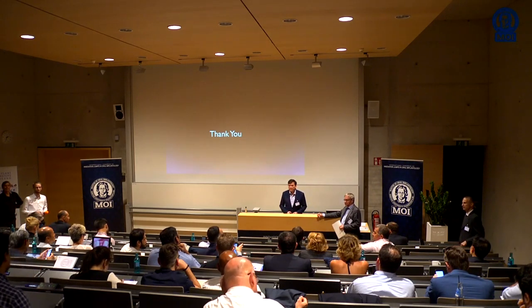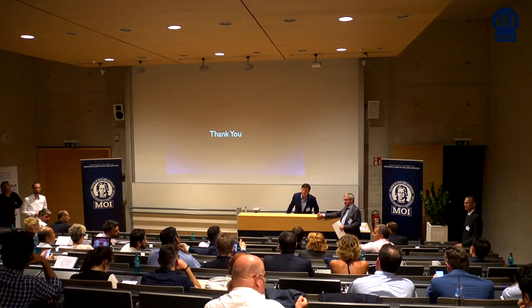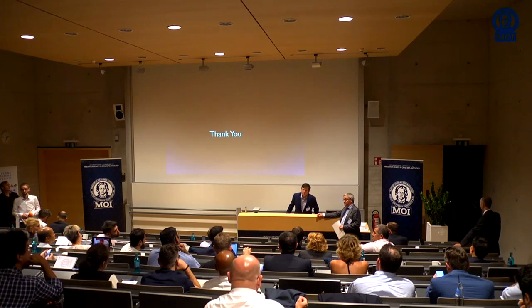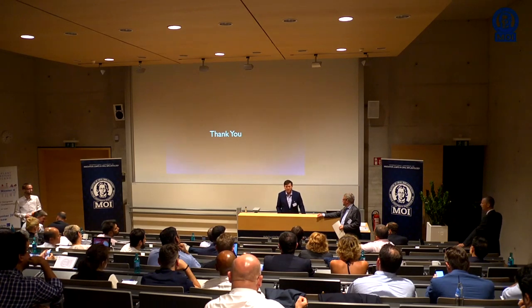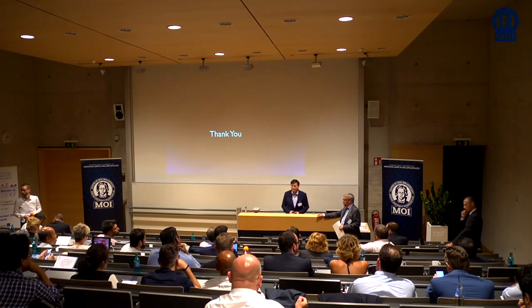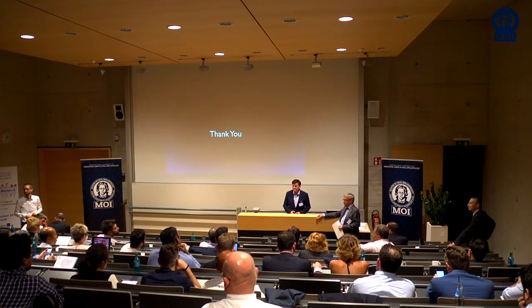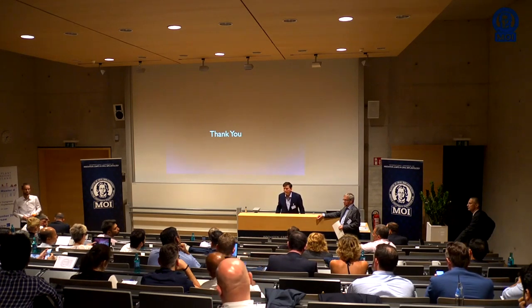Alveolectomy following implant placement, yes, I do. When you place a long implant, you're drilling longer into bone, so you're probably generating a little bit more heat with a long implant passing through the area that you're going to alveolectomy at the end anyway. Have you found any problems with crestal bone loss? I haven't at all, not yet. But that's certainly something worth keeping in mind. I have a question regarding the amount of bone.